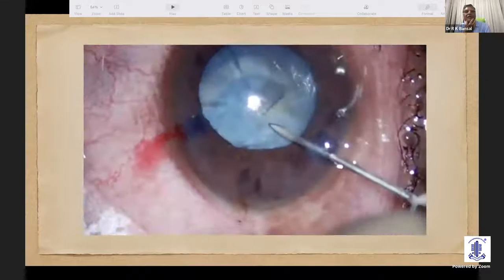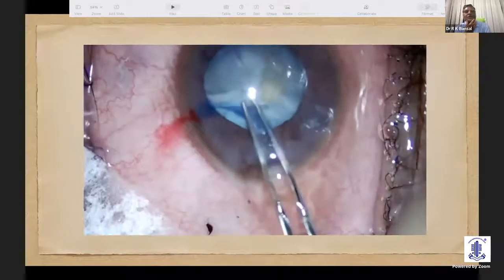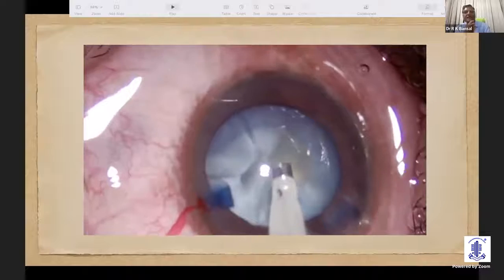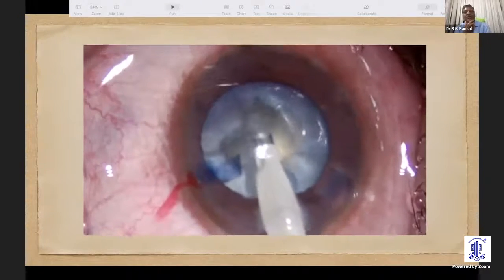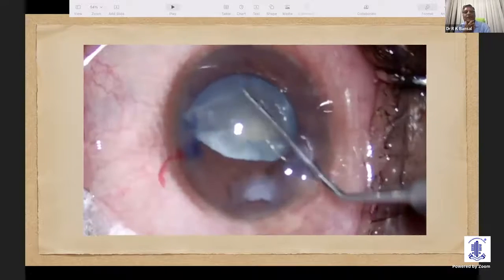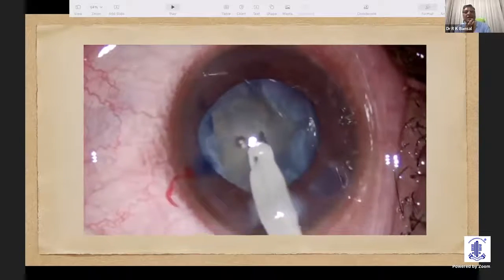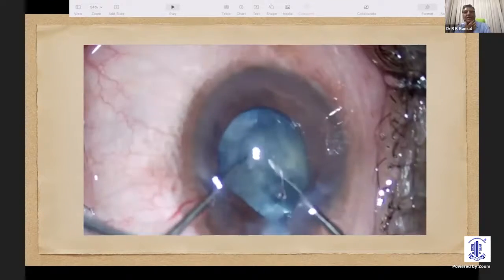You can see here, just on this side, there is a tear of the capsule and it is going to extend into the periphery. This is the dilemma we face — if we don't encounter an Argentina flag sign, sometimes we can face extension of the rexis right into the periphery. We have to assess whether the tear is extending into the posterior capsule or not. One can look for the flap motility sign and other evidence of extension into the posterior capsule.